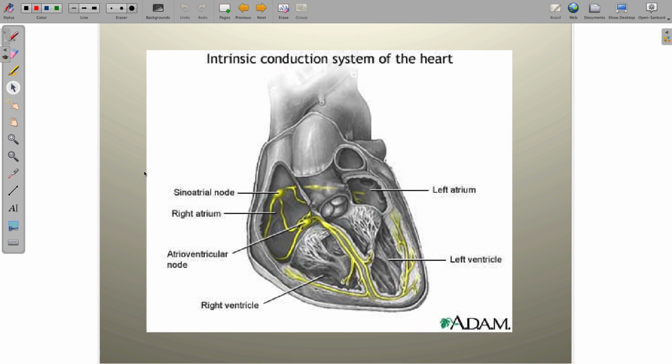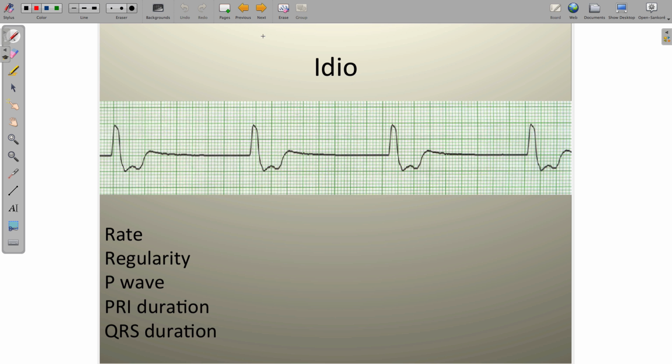All right, so first thing I want to refresh your memory on is that now we're talking about something that's going to come about from the ventricular tissue. So before we talked about SA node, we talked about atrial, we talked about AV junction. Now we're looking at stuff that's coming from either interventricular septum or ventricular walls itself. We're talking about ventricular tissue, and remember that ventricular tissue kind of has this inherent firing rate of somewhere like 20 to 40 beats per minute. All right, so keep that in the back of your minds. And let's take a look at our first one.